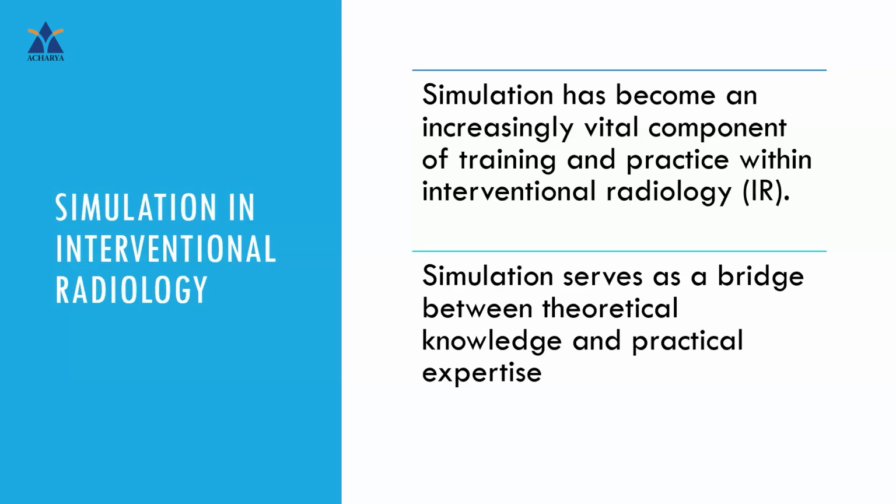That is, virtual reality will create an immersive computer-generated environment, whereas simulation is a process of creating a model of a real-world system or process. So it can represent behavior or characteristics, and it can be used for training and for analysis purposes. So you'll require different computers and physical models to replicate the aspects of the real-world scenario.